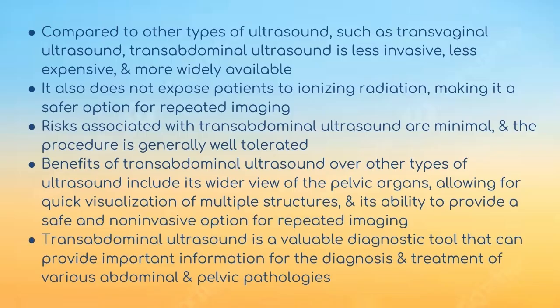Risks associated with transabdominal ultrasound are minimal, and the procedure is generally well tolerated. Benefits of transabdominal ultrasound over other types of ultrasound include its wider view of the pelvic organs, allowing for quick visualization of multiple structures, and its ability to provide a safe and non-invasive option for repeated imaging. Transabdominal ultrasound is a valuable diagnostic tool that can provide important information for the diagnosis and treatment of various abdominal and pelvic pathologies.